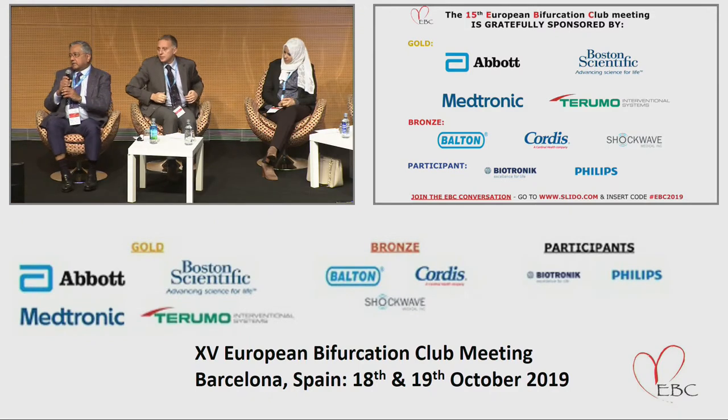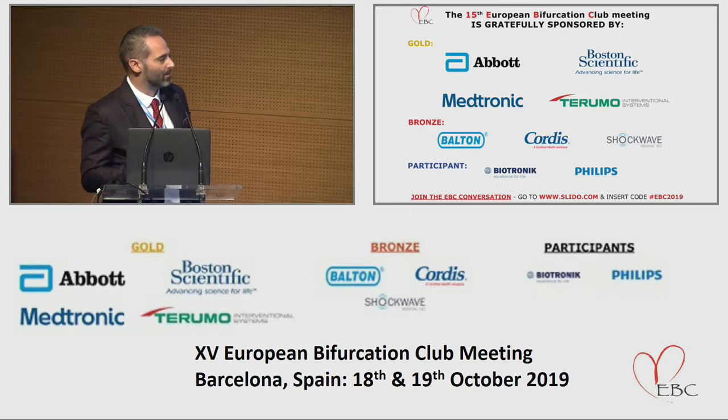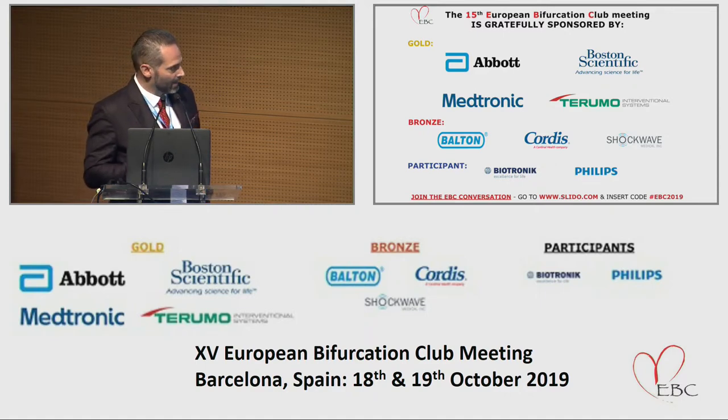Always this question about precision of coverage at the ostium, because you really want to cover the carina. How can you be absolutely sure? One millimeter, two millimeters, five? That's another point that we discuss in front of beer most of the time around the world. And I agree that you cannot be sure 100% that you are crushing only one ring or at maximum one millimeter. But the technique implies that you crush at maximum 1 millimeter.